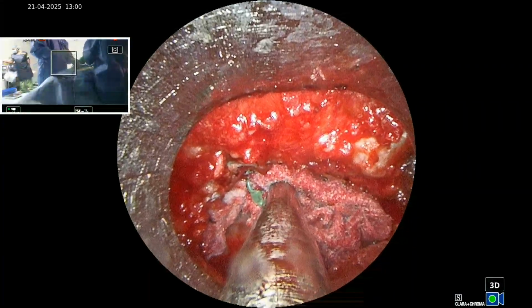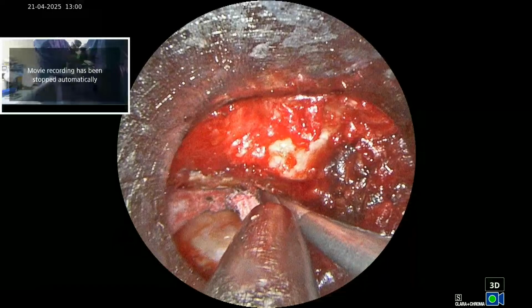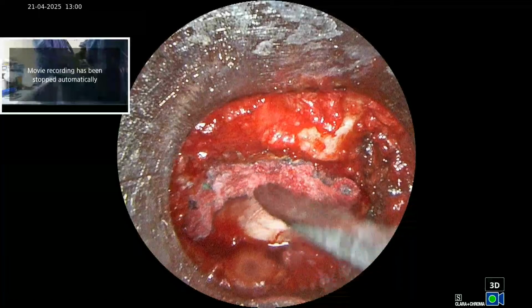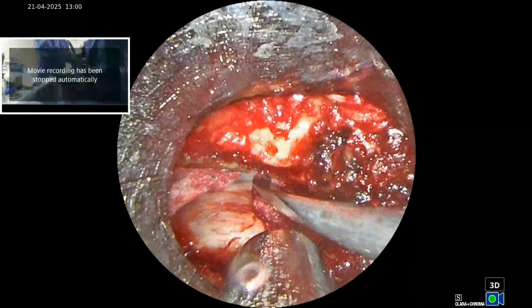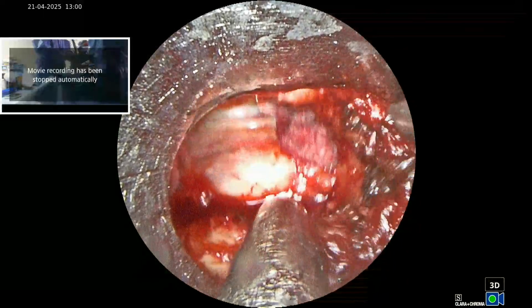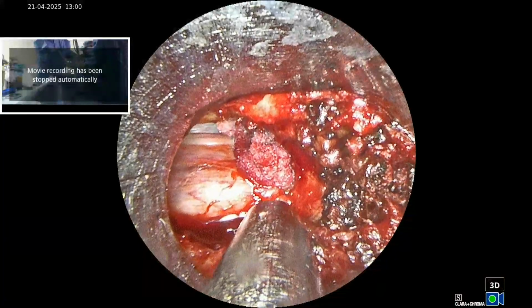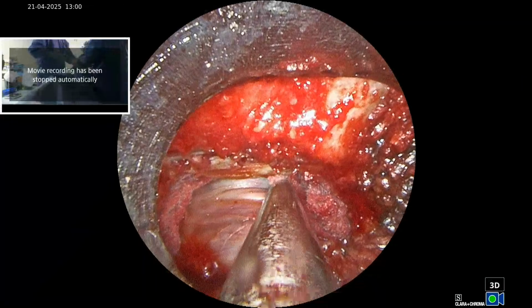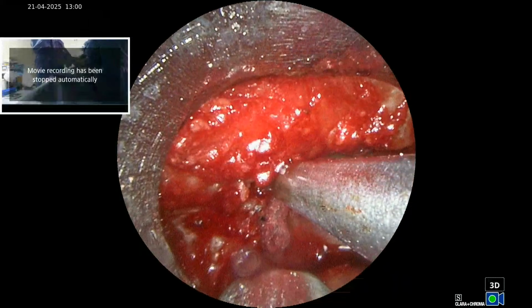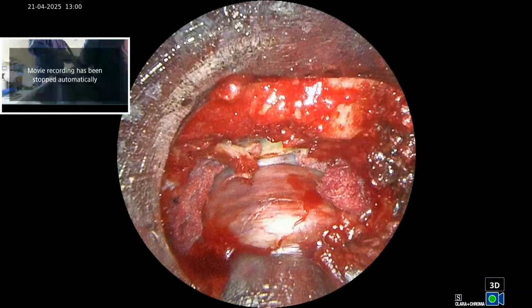So now we have crossed the midline, so we are going to the opposite side, repositioning our patty at the opposite side. We will try to put the nerve at the shoulder of the nerve root, the cranial patty, in my caudal patty, very tight canal. So, hypertrophic portions of the ligamentum flavum of the opposite side.